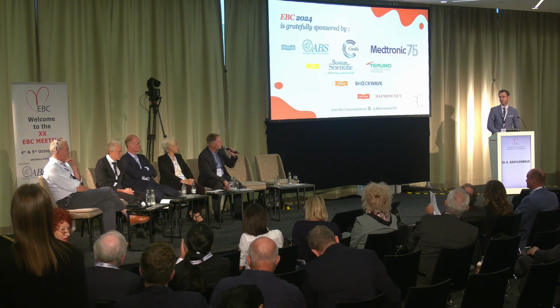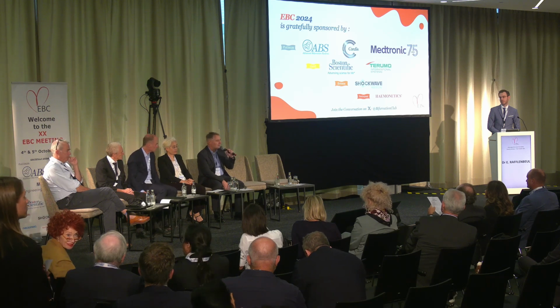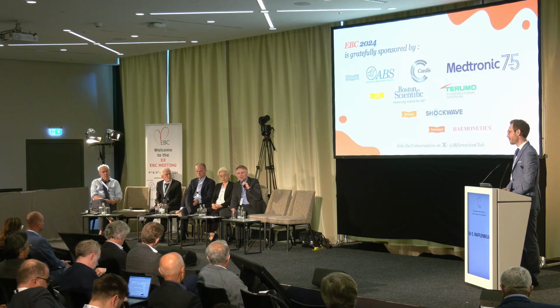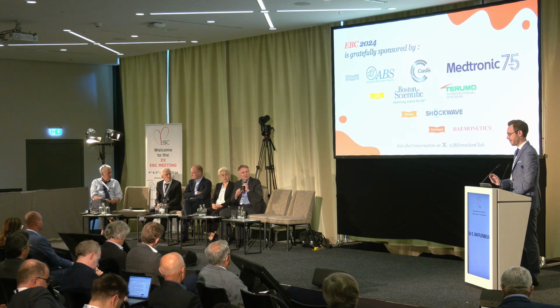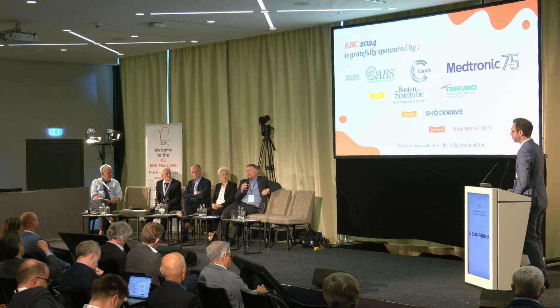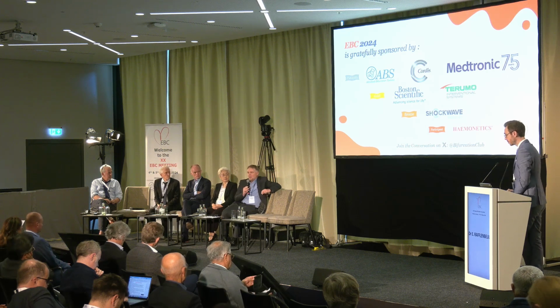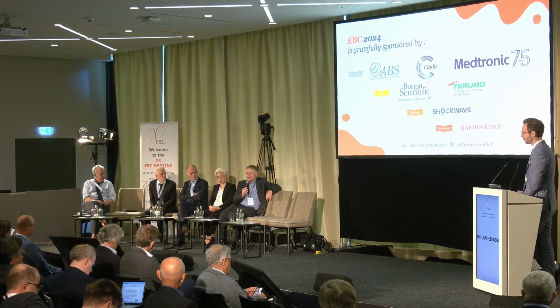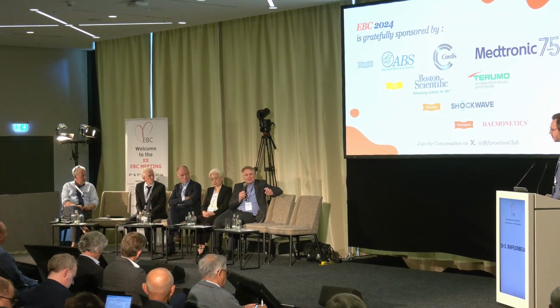Thank you very much. Great talk. I was invited last week at the German autumn meeting in Hamburg to give a talk on DCB, and we also had a live-in-the-box case on de novo disease. And we were told that if you see such a dissection in a major artery, the guidelines clearly say you have to stent it. What is your answer to this?